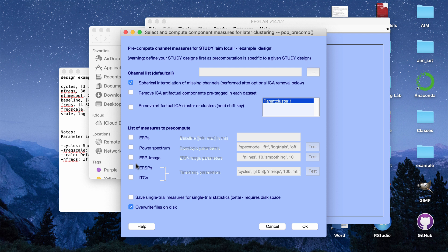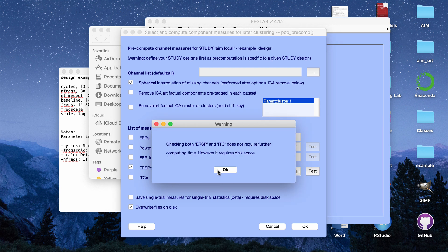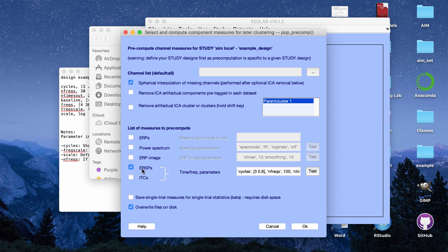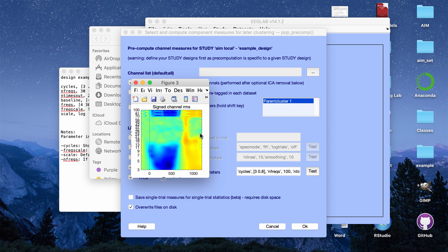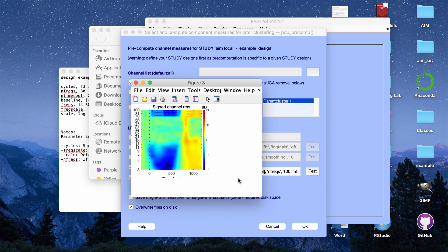This is where we specify we want a time frequency analysis. Under 'List of Measures to Pre-compute', we're going to pre-compute ERSPs — Event Related Spectral Perturbations — and the Intertrial Coherence, or ITC. It then asks for time frequency parameters, which let you customize what your time frequency plots look like. If you click the Test button, it gives you a sample time frequency plot based on the parameters you specify.